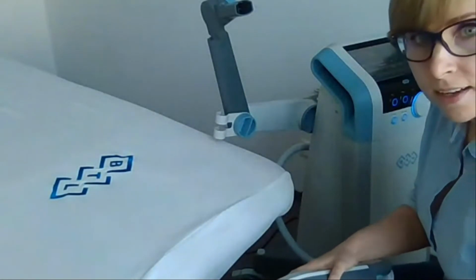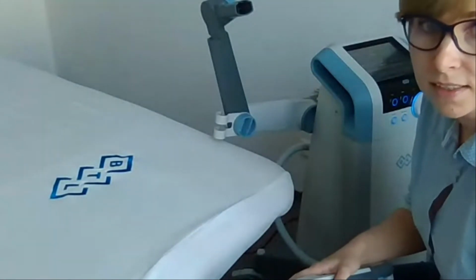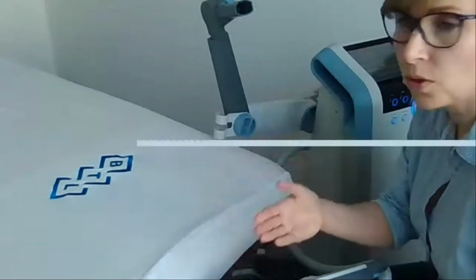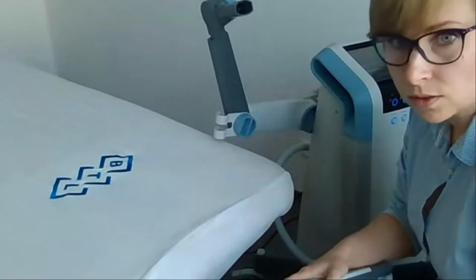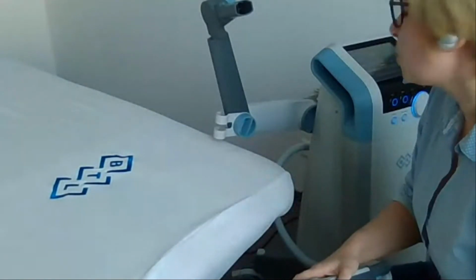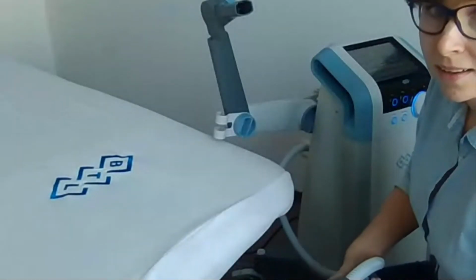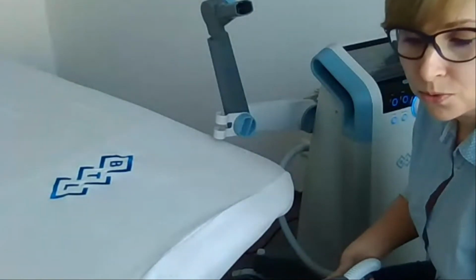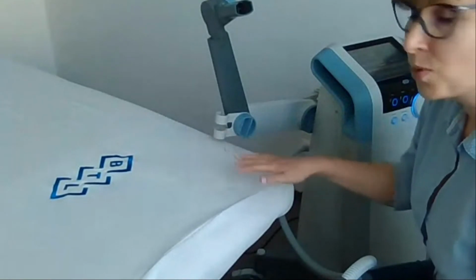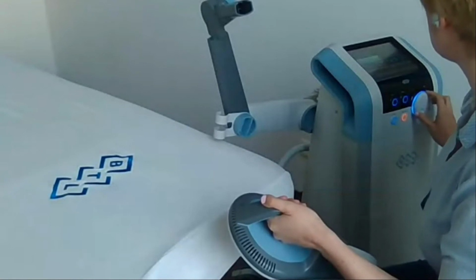I will not hide that I had to check what kind of intensity it is good to apply in example of nerve, in example of muscle, to be sure that you know how small intensities we need to apply. But in this case, that I have some limitations to present you how the device works and how the treatment looks like, I had to prepare it before. So I will start with the therapy.